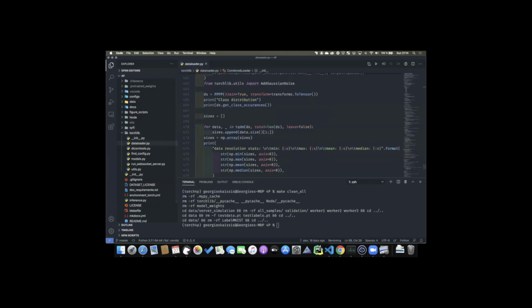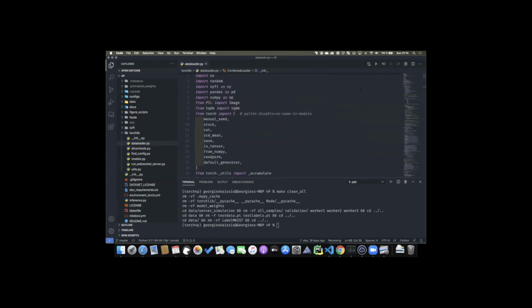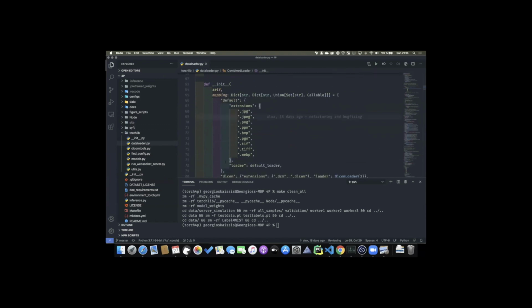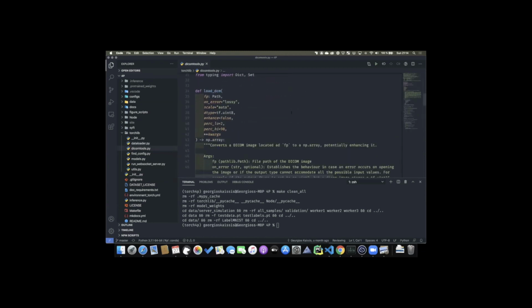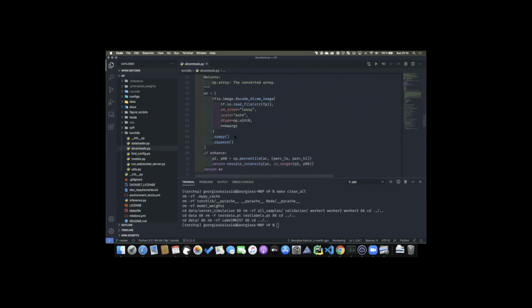You can look at the data loaders, and I'll show you one example of the data loader that we have, which is called a combined loader. It was made to handle both regular imaging, but also medical imaging formats. So PriMIA is automatically handling DICOM, and you can even combine DICOM and regular JPEGs. You just throw it in and it'll load it anyway and convert it. All the logic for that is in DICOM tools. So if you want to make changes to whatever DICOM loading procedure, you'll find that here.